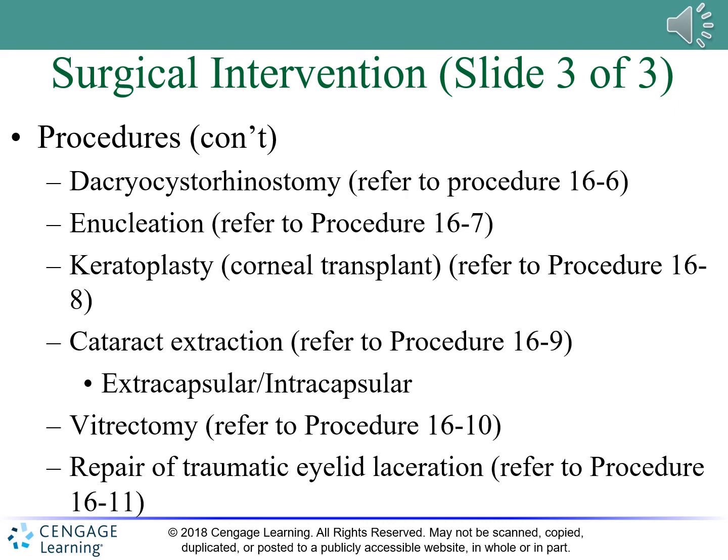And on pages afterwards. Okay, so on 620, where it says plate 16-14, see how it's folded? I wrote above it that the IOL can be flat, folded, or rolled and passed through a tube, which we underlined, but I'm just reiterating here to make sure that you remember that the IOL can be flat, it can be folded, or it can be rolled and passed through a tube. So that takes us to 621, the vitrectomy.